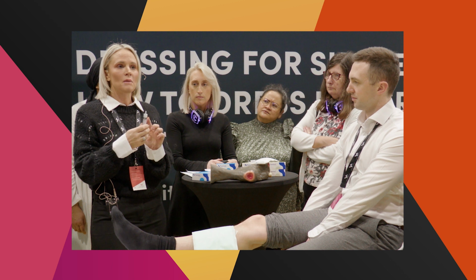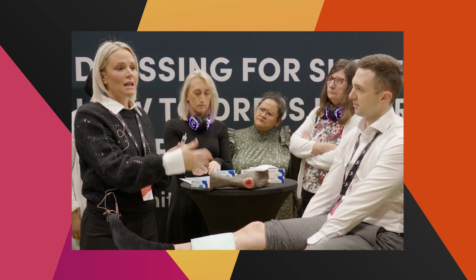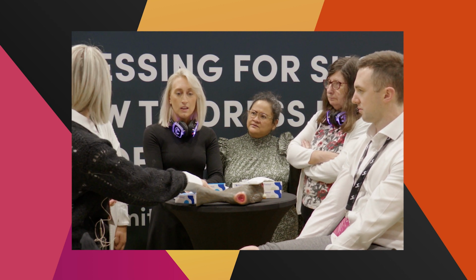Okay, and then you can measure volume. So if you put 5 mils in today, Adam is not a clinical nurse. If I could only put 5 mils in, he would only be able to get 5 mils in. You can't overpack, you can't underpack. So really good for shared care as well. But if you put 5 mils in, don't expect 5 mils out, because you won't. All right, I shall pass you over to Lou.